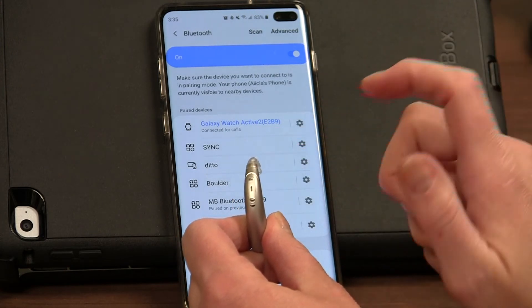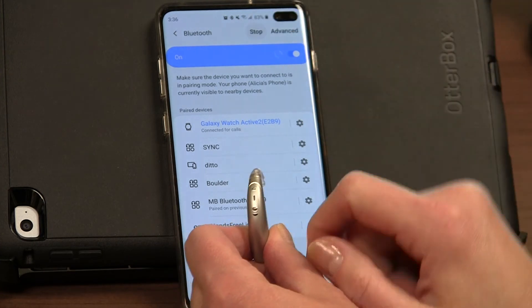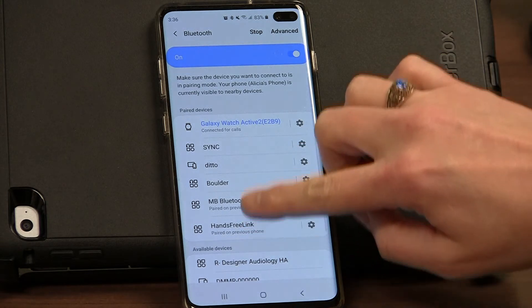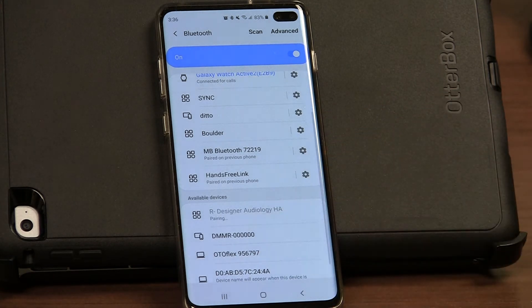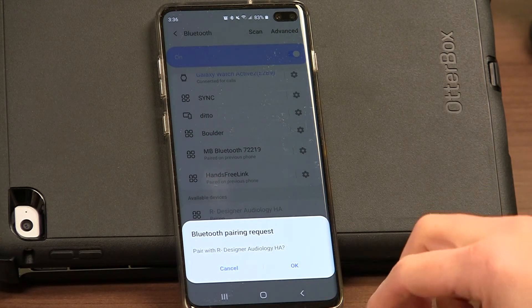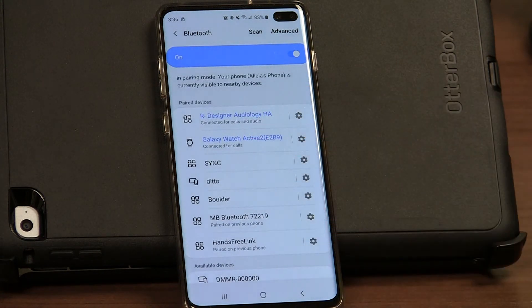Now that I've turned the hearing aid off and back on, I'm going to hit scan so it can search for that device. When we scroll down our list of available devices, you can see 'R for right, Designer Audiology hearing aid.' I'm going to click on that. It will tell me that it's pairing, and it will ask if I want to pair — I'm going to say OK. And then up top when it's done, you can see that it is connected for calls and audio.